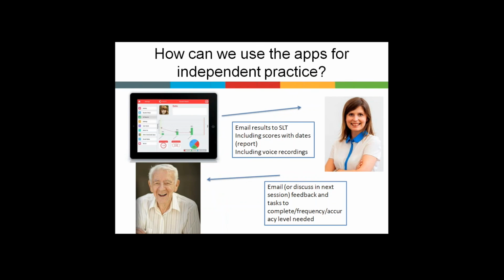We talked a little bit about how the app nicely supports somebody going away and doing practice on their own. And I think most of our clients are keen to do this if they have their own iPad, of course. So in this way, the client can be set up with tasks by the therapist, from setting up the content, taking the photos, deciding how many tasks to do, etc. So the therapist really still is helping the client decide on content and the nature of the task.